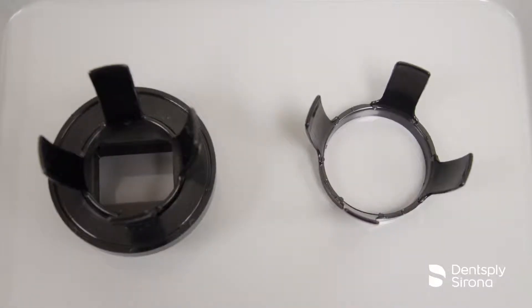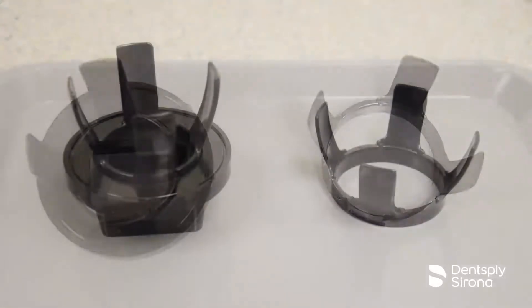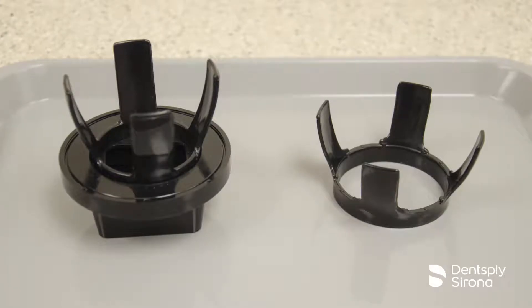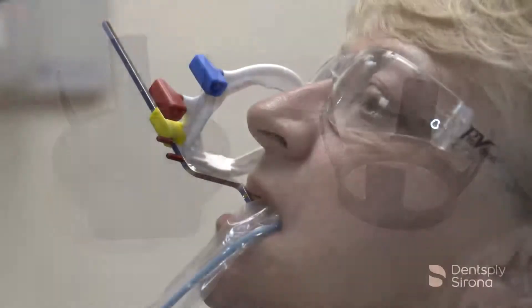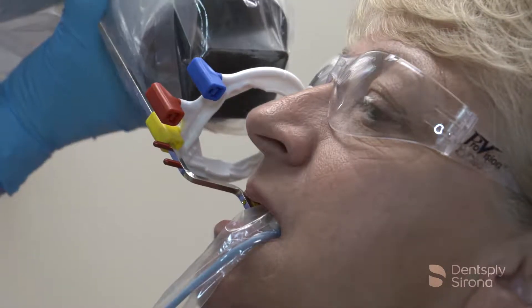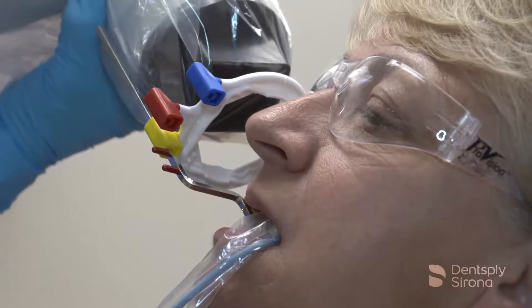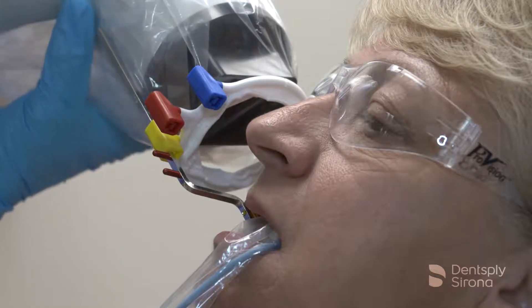The RIN universal collimator allows the clinician to align the beam and prevent misfocusing of x-rays by absorbing divergent radiation, and reduces the patient radiation dosage by 40 percent. Collimation protects patients by limiting the size of the primary x-ray beam to the size of a number two film. The RIN universal collimator complies with the NCRP Report 145.